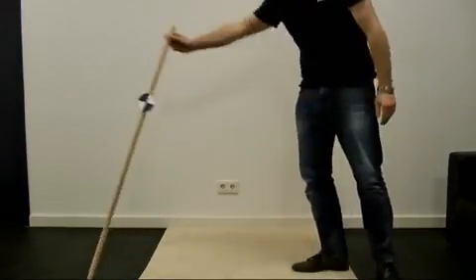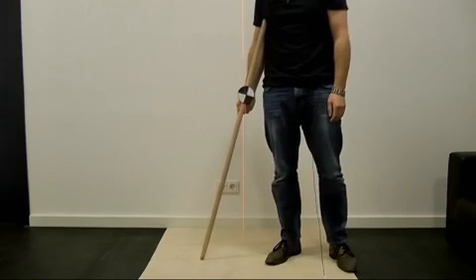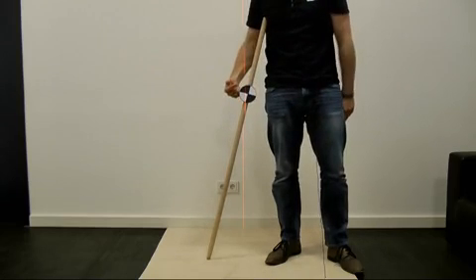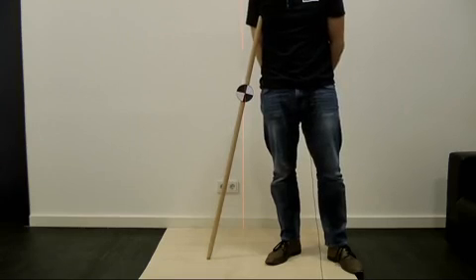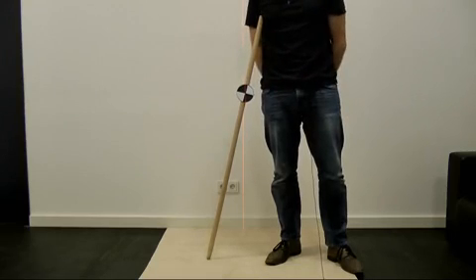For this reason, we have reduced the patient to the most simple object of all. We have taken a broomstick in hand and have simulated a body center of gravity, which has been marked here. We want to ask the question if this broomstick, which is standing next to me, is actually able to stand or not, or what happens to the broomstick next to me.